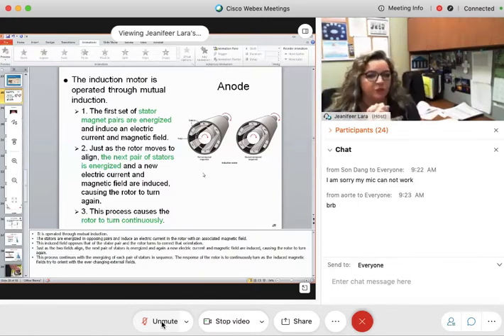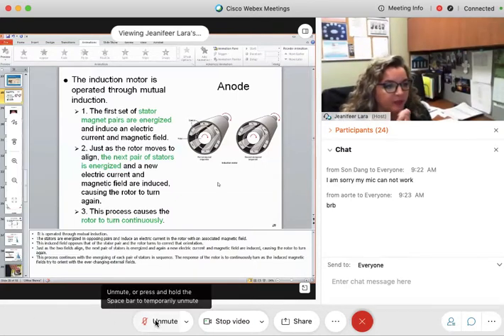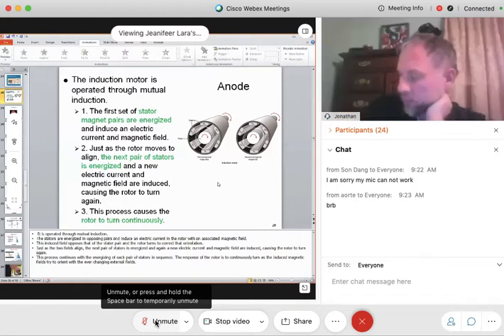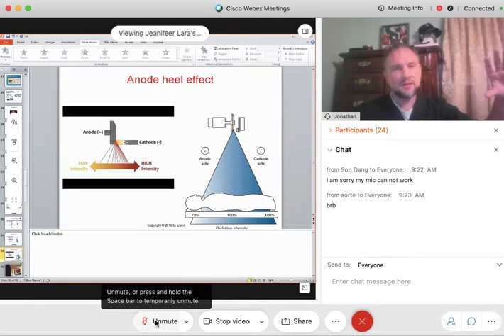What else? Jaleisha, you with me? What are the questions I have before I move on to the cathode? So in the book, when it was talking about the anode heel effect, it was saying that the intensity is lower, and on the anode side the image is lighter.